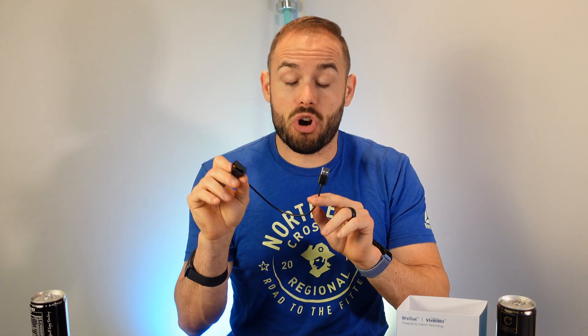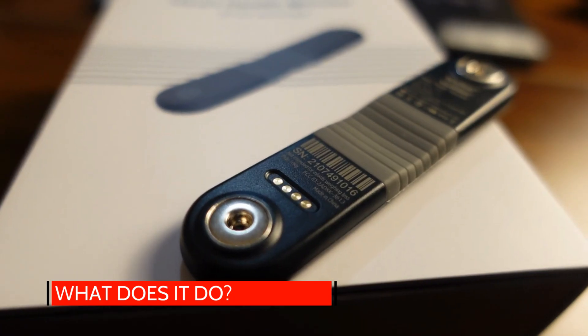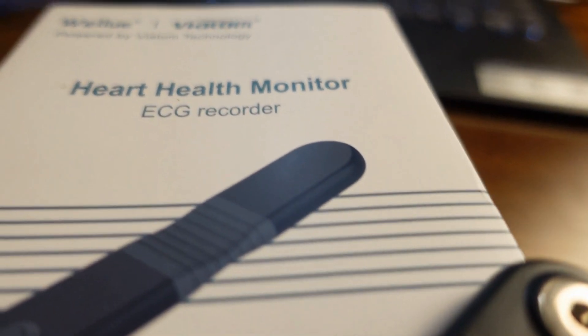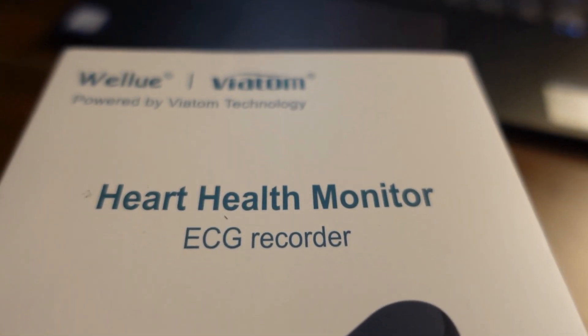It also has its charging cable slash data cable as well. So what does this device do? It does 24-hour heart rate monitoring with ECG, and it does an AI analysis throughout the day to figure out any type of abnormal rhythm to your heart. It says it can intelligently identify up to 14 types of abnormal ECG events. Atrial fibrillation is one of the more common ones, but there are a lot of other ones it can detect as well. You can also get real-time tracking through the app.